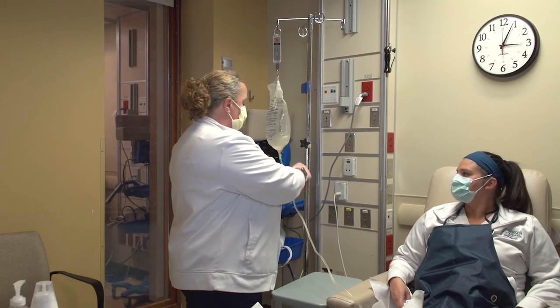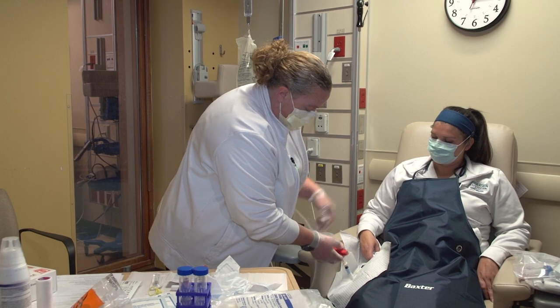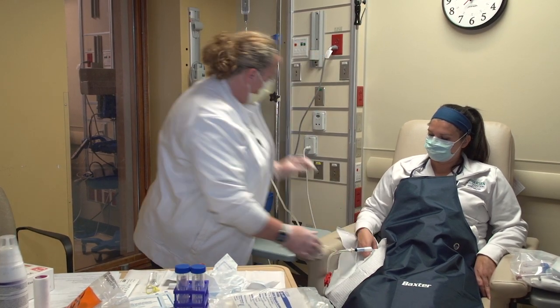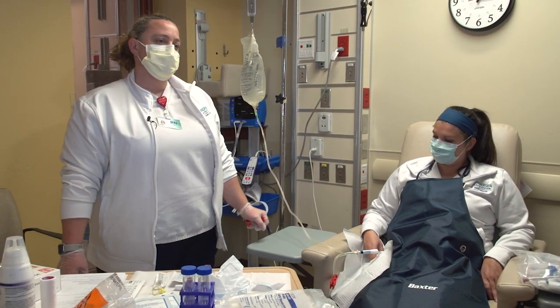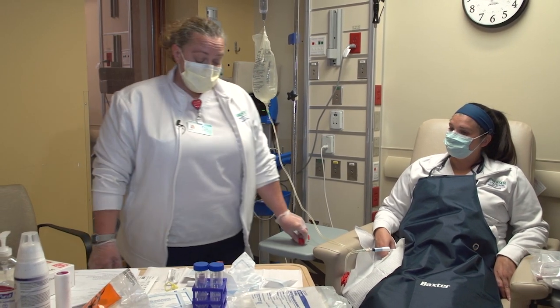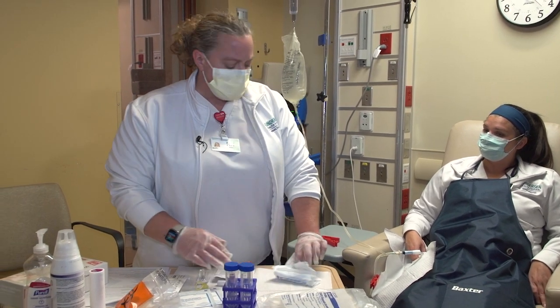Once that's at 2 liters, clamp both your lines. Open your transfer set back up, and then fill the bag with the 2 liters. That would take approximately 10 minutes depending on the patient.